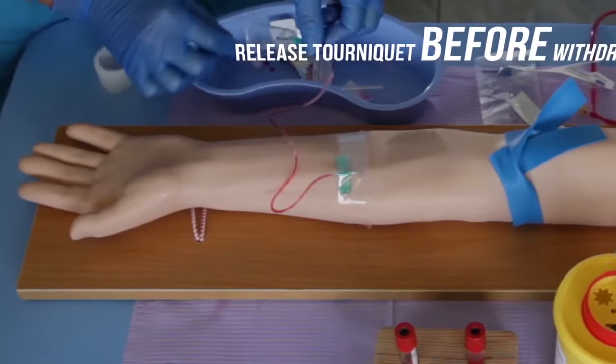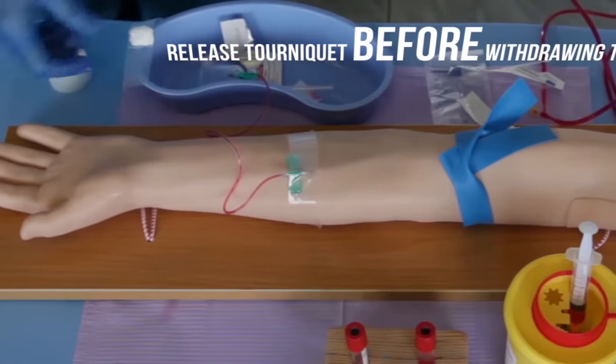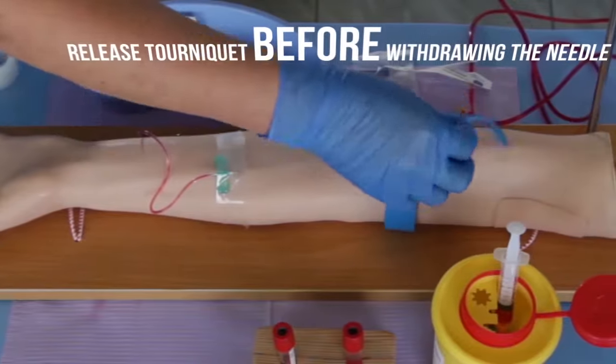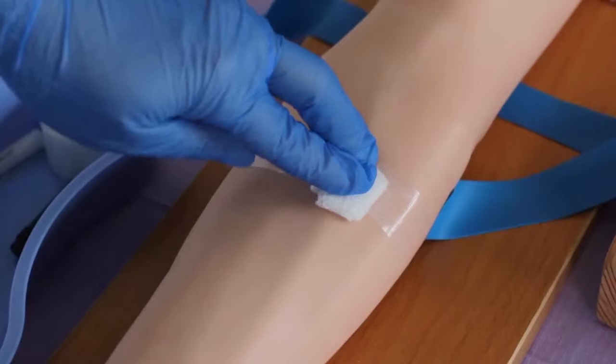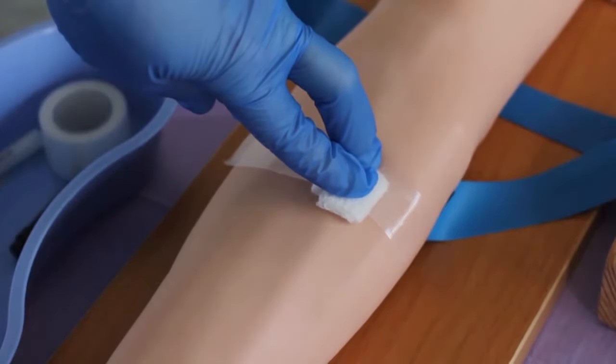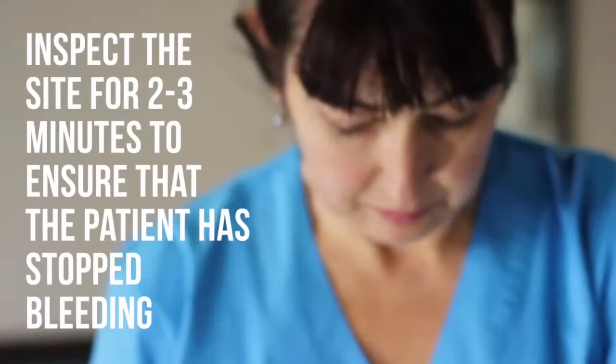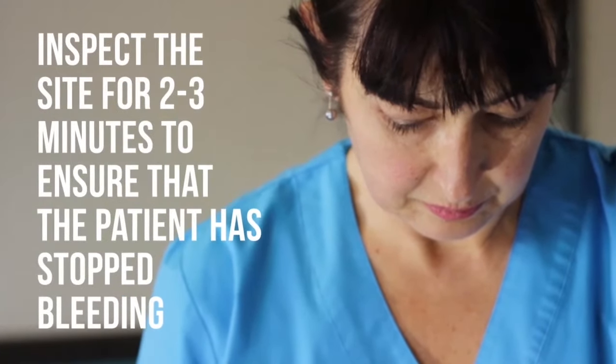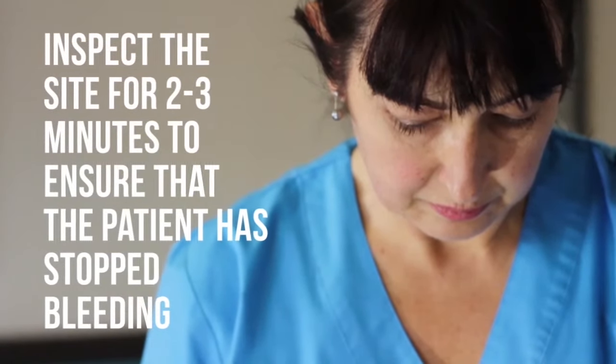Once sufficient blood has been collected, release the tourniquet before withdrawing the needle. Withdraw the needle gently and place a clean gauze or dry cotton wool ball with strapping to the site. Apply with firm pressure to achieve hemostasis and avoid a hematoma. Inspect the site after 2 to 3 minutes to ensure that the patient has stopped bleeding.